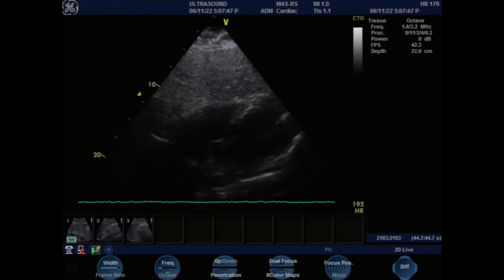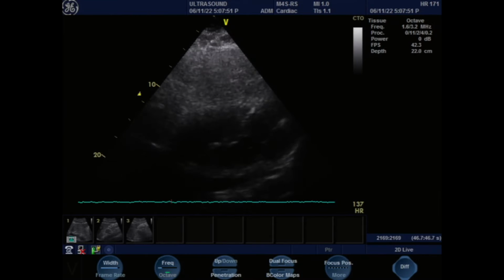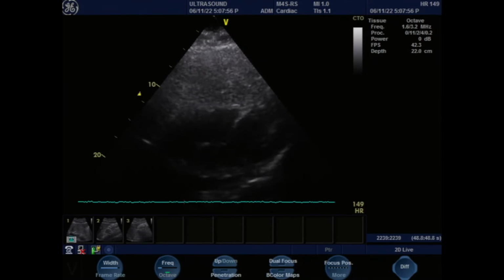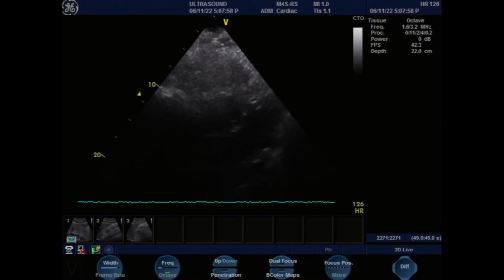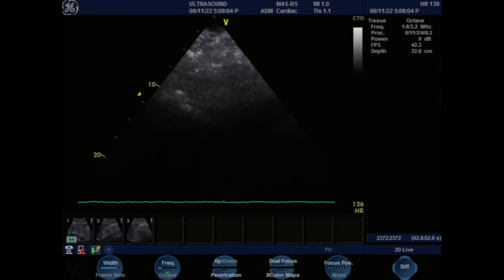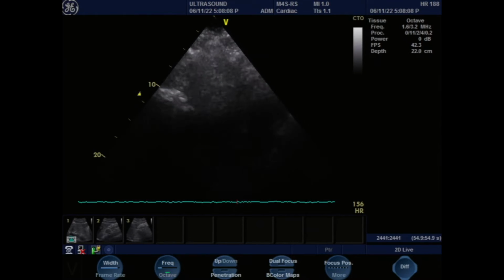So what we're looking at now is the heart, but you remember when we saw it in the 4-chamber view where it was upside down? We're essentially looking at a similar view, except it's cut that way. If the heart is sitting here, I just cut it this way and I'm looking at it from the top. I slice the heart from the top to the bottom.